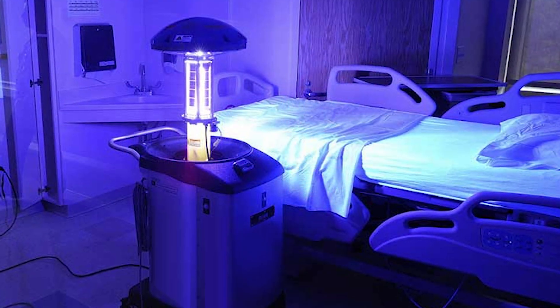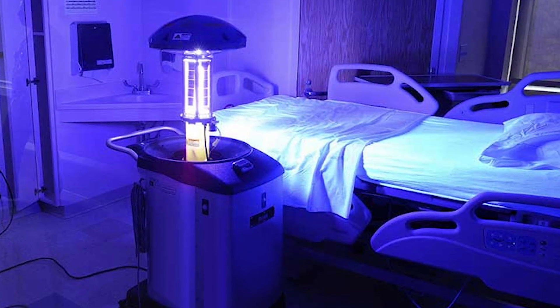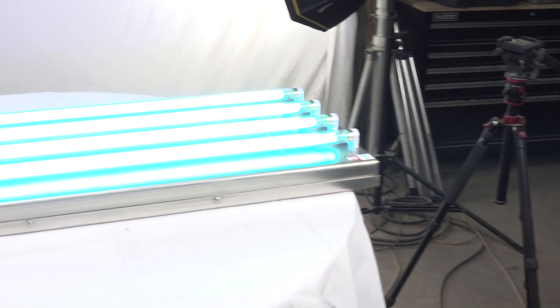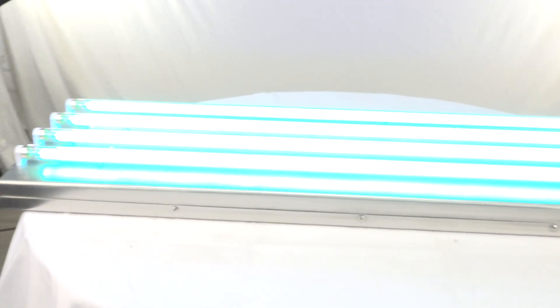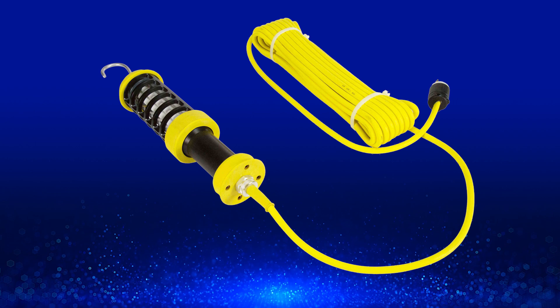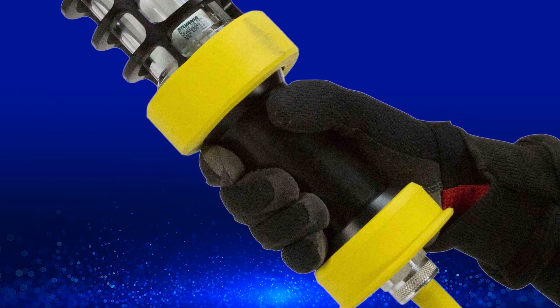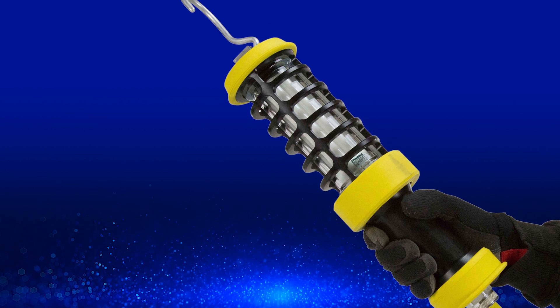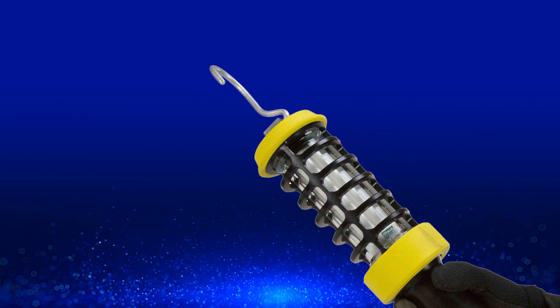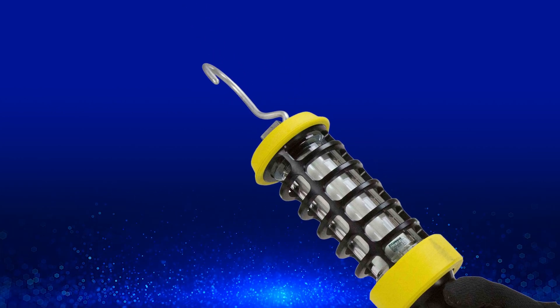Ultraviolet radiation can effectively eliminate the virus without needing to come in direct contact with potentially contaminated surfaces. Our handheld solution can be used for close-up sanitation via a non-slip handle. The UVC lights also offer hands-free operation with a sturdy hook on the light head.